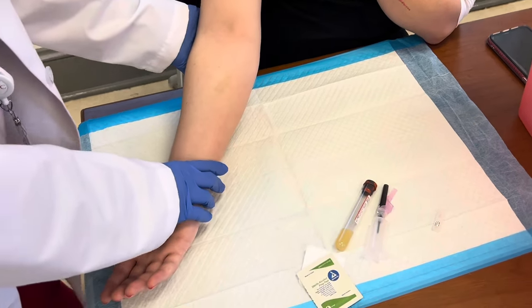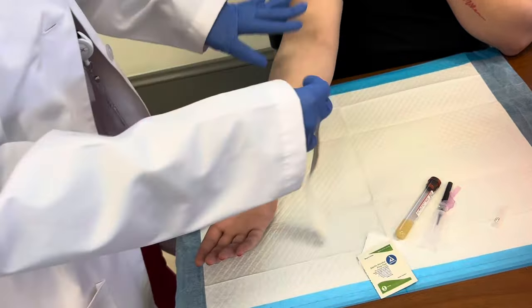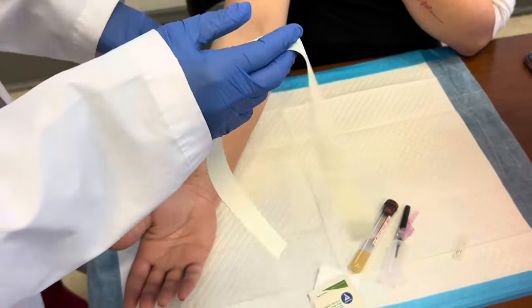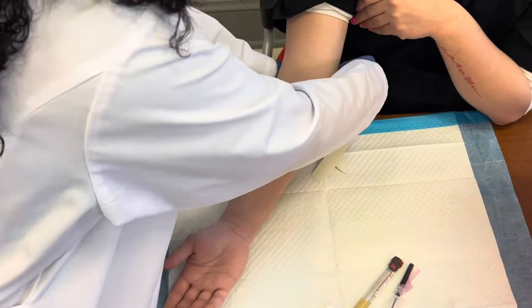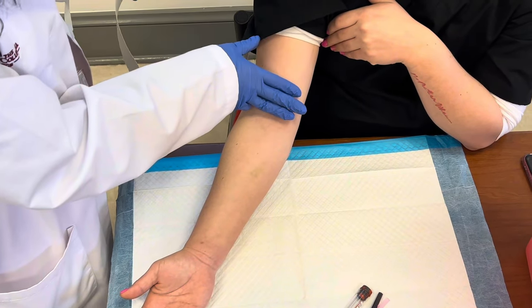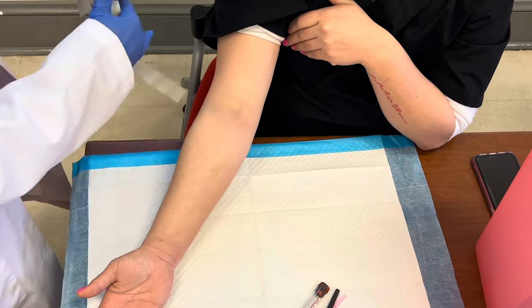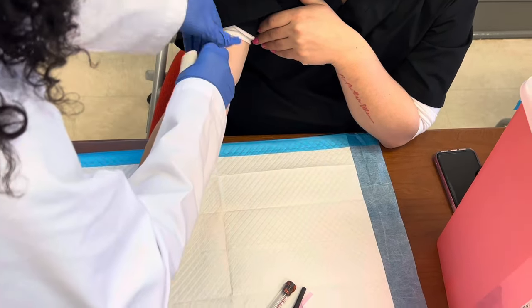First of all, we're going to get her arm preference. She chose this arm. I already checked both arms — both arms weren't so great, but this one had a little something. So we're going to have our patient put on the tourniquet three to four inches above the elbow, which is about two to three fingers depending on how big your fingers are. We're going to tie that tourniquet there.